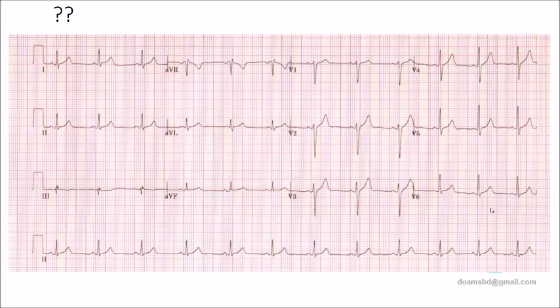Thank you, doctor. Please, everybody interact. Otherwise, this is a normal ECG. And is there any irregularity? Possibly no. There may be some little irregularity due to the sinus arrhythmia. Inspiration and expiration can change it a little in some leads, from lead to lead.